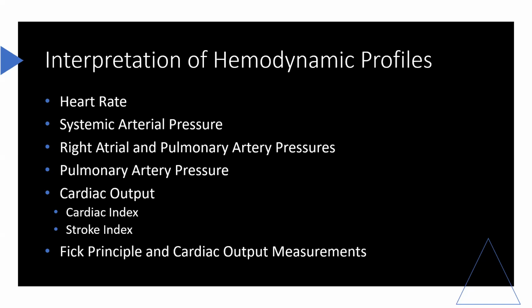Calculation of oxygen content requires the measurement of oxygen partial pressures and saturation for oxygen of arterial and mixed venous blood. Arterial samples can be obtained from a peripheral artery. Mixed venous blood samples can only be obtained during right heart catheterization by withdrawing blood from the pulmonary artery.